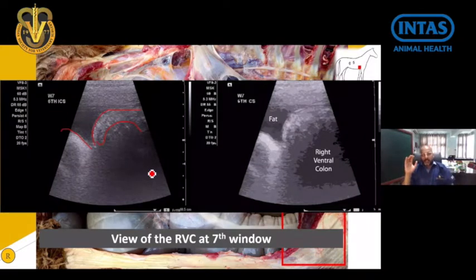Now make sure, the ultrasound doesn't have a deep penetration. So in case of large animals, especially horses, forget about looking deeper as you do in small animals. You have to be superficial and look at certain points which I mentioned earlier: its position, wall structure, displacement, the presence of fluid, etc. We will develop this as we move forward, but never expect a deeper lesion within the abdominal cavity to be diagnosed with the help of ultrasound.